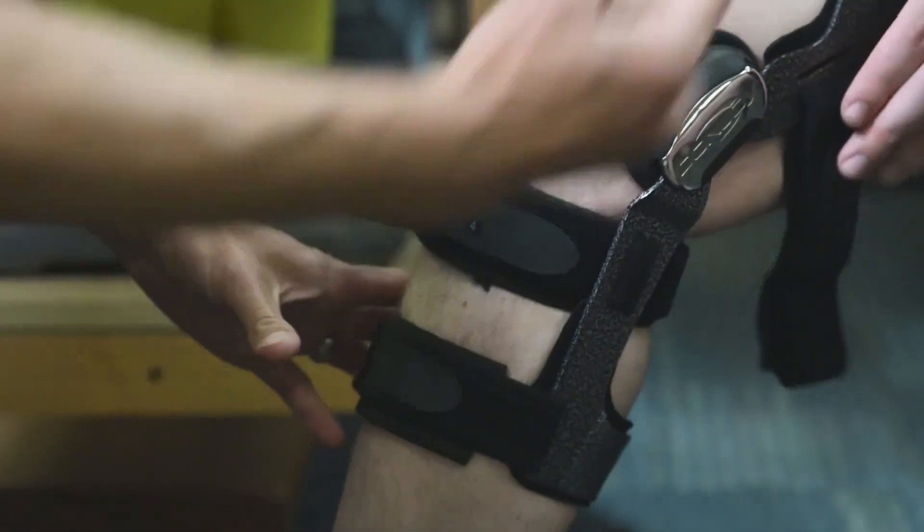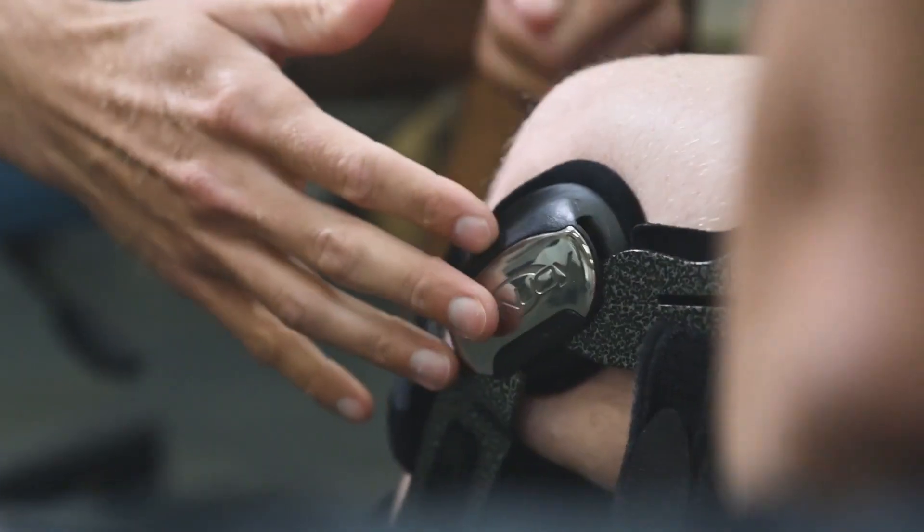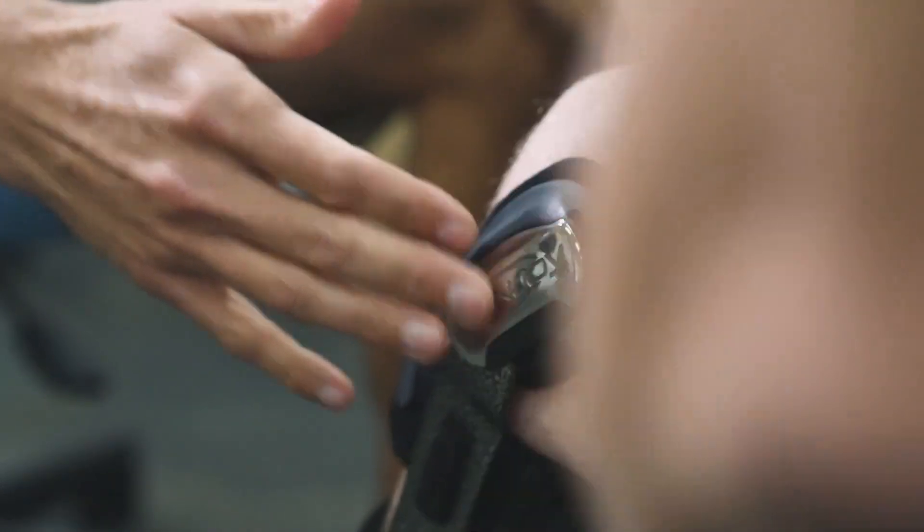We could greatly reduce, if not almost eliminate, their timeout or their significant injuries by wearing that prophylactic bracing, especially with the Armour.